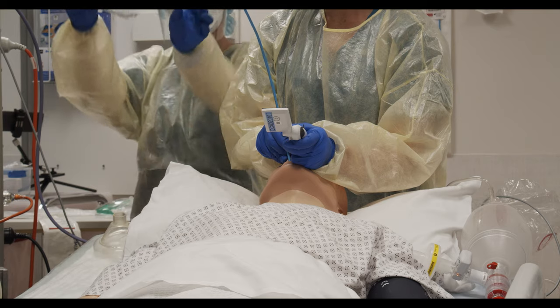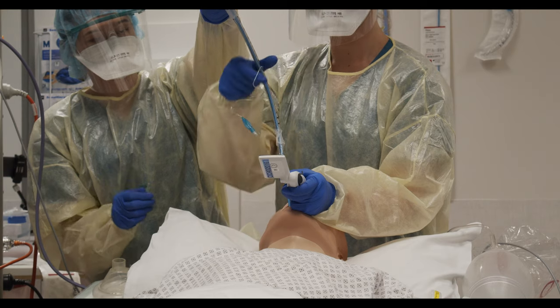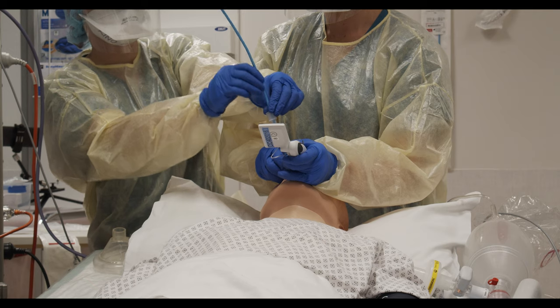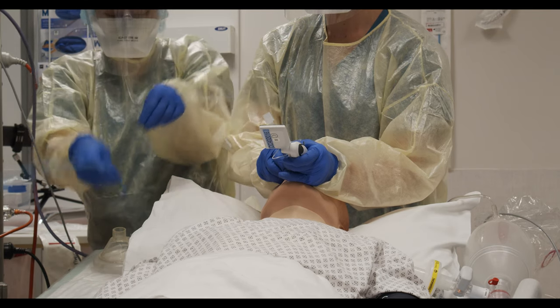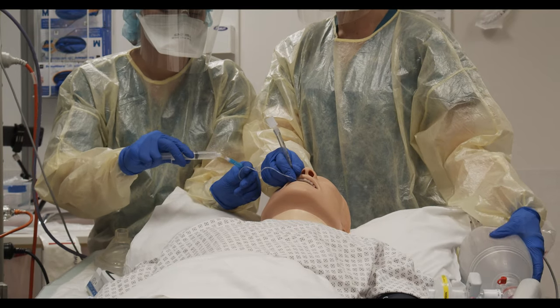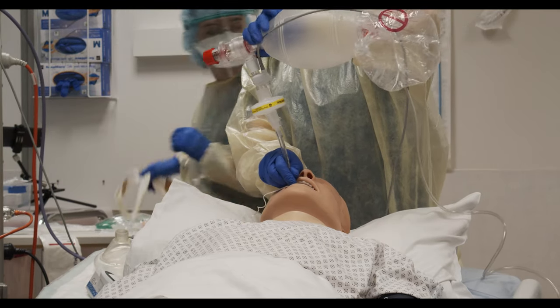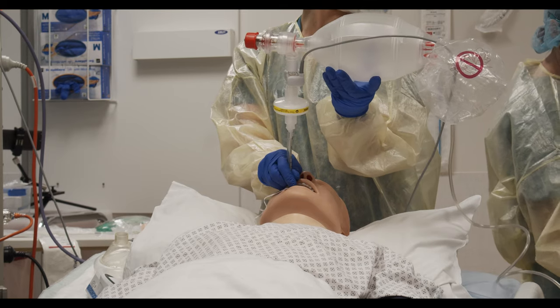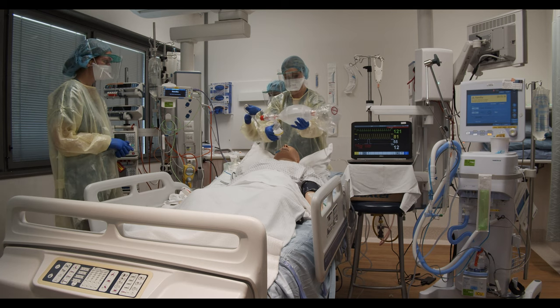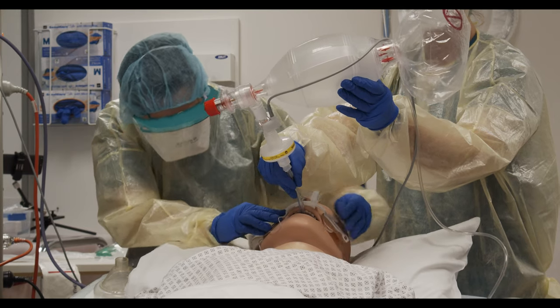Okay, I've got bougie. I've got the top of the bougie there. Okay, and I've got the tube. Okay, bougie out. And then cuff up. That's one slide right there. Oxygen on. Okay, so if we can secure that. Okay, so I'm just sticking this down onto your face there.